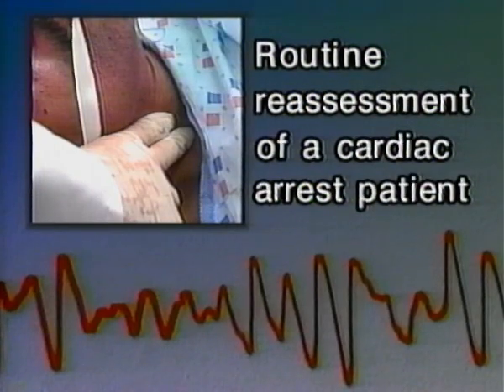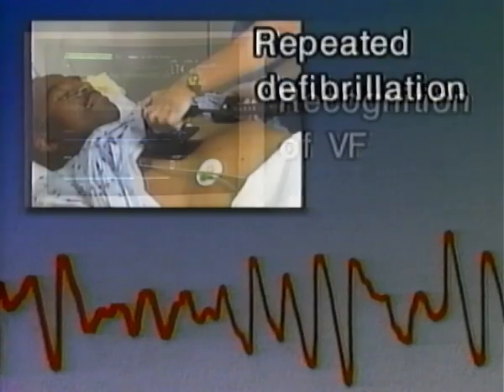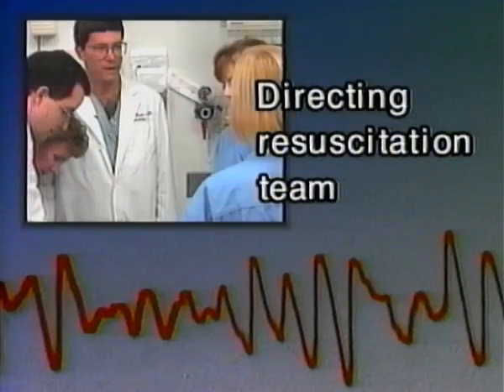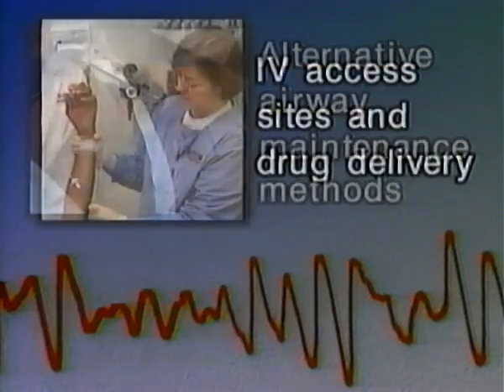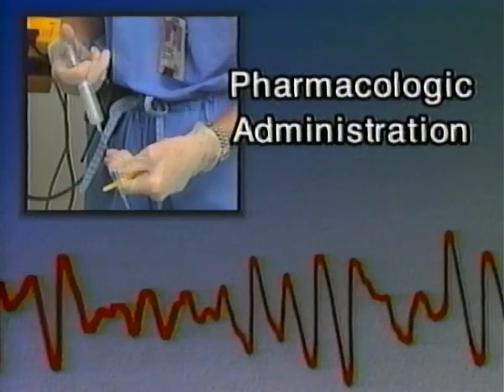reassessment of a cardiac arrest patient, recognition of a VF and/or pulseless VT, repeated defibrillation with a standard manual defibrillator for VF and/or pulseless VT, attaching ECG monitor leads, directing the resuscitation team to provide multiple interventions, endotracheal tubes as a drug delivery route, alternative airway maintenance methods when endotracheal intubation is difficult, IV access sites and drug delivery for cardiac arrest patients, and pharmacologic administration of agents for a cardiac arrest patient.